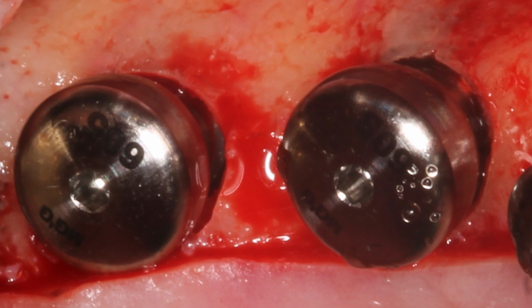Therefore, profiling it precisely, leaving roughly a millimeter gap, does allow the epithelium to migrate into the area and form a new layer of periosteum, which also is going to be part of the sealing mechanism for the future permanent abutment. So this is prudent. This is very important to look at this image and create that uniform thickness of space around the bone to the healing abutment interface.